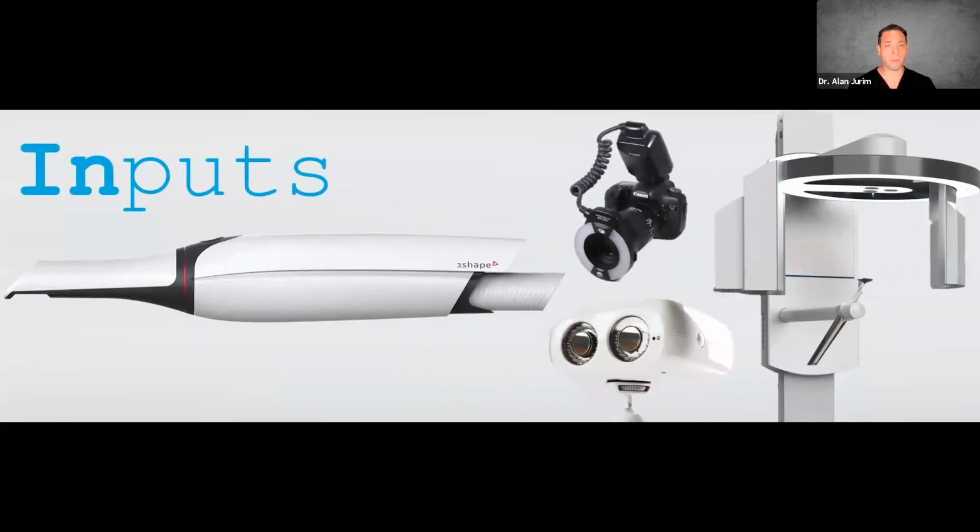So when we talk about inputs, we're talking about acquiring data, right? We're talking about 3D scanning with an intraoral scanner. We're talking about photography, 3D x-rays. What we see on the bottom there is a PIC scanner. It's a device we use for our full arch implant cases. So it all begins with us acquiring this data.